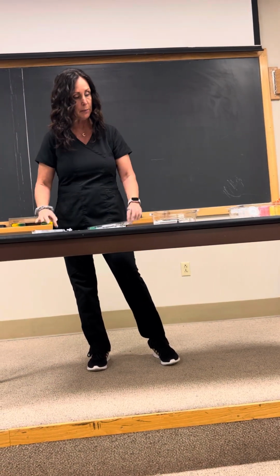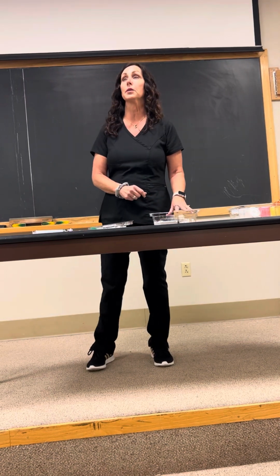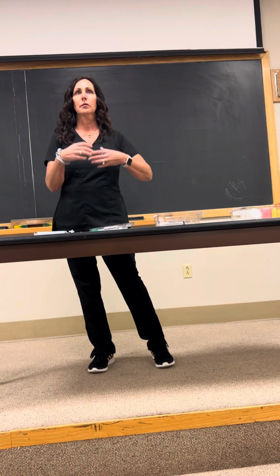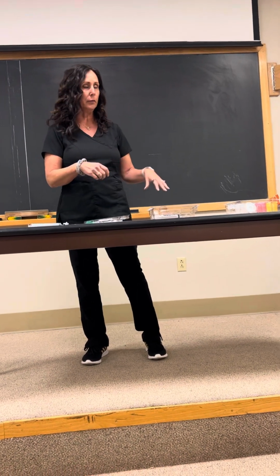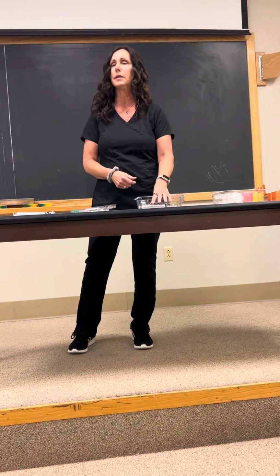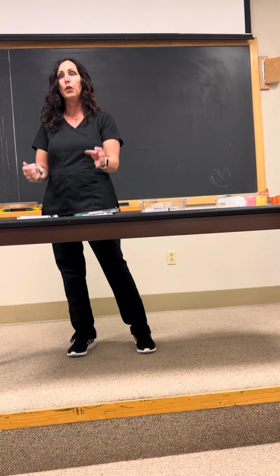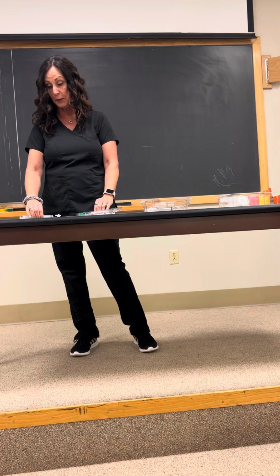The surgeon is going to be drawing the marrow with two 30 ml syringes because there's less pressure gradient on the marrow, which reduces the clotting. So they're going to use a 30 ml syringe to draw the marrow. You're going to filter both 30s into the 60 to give a full 60 mLs.